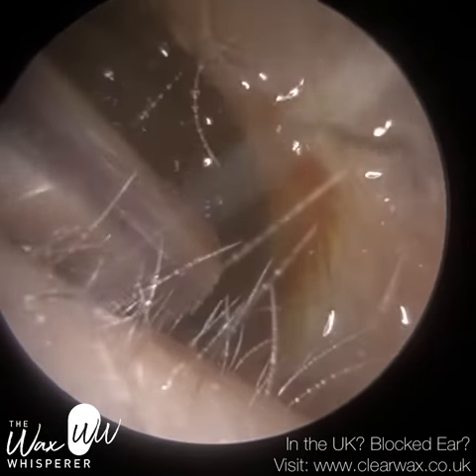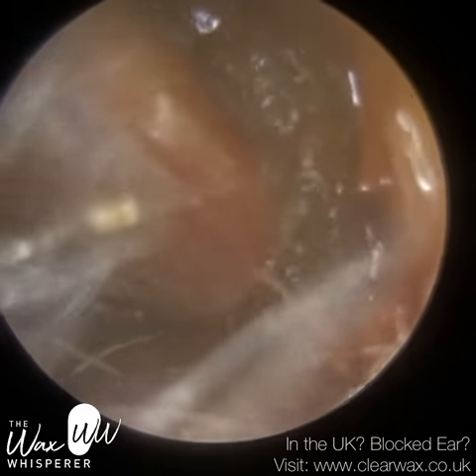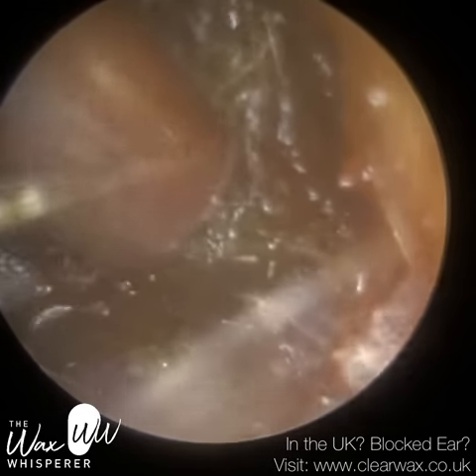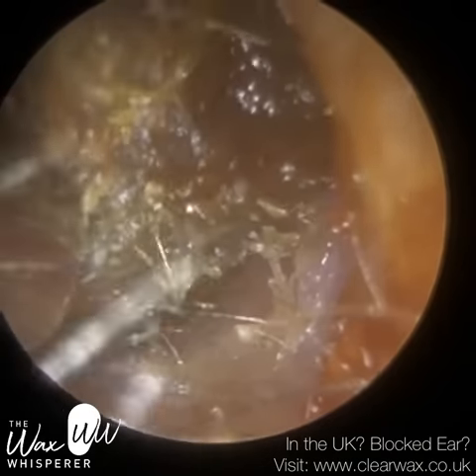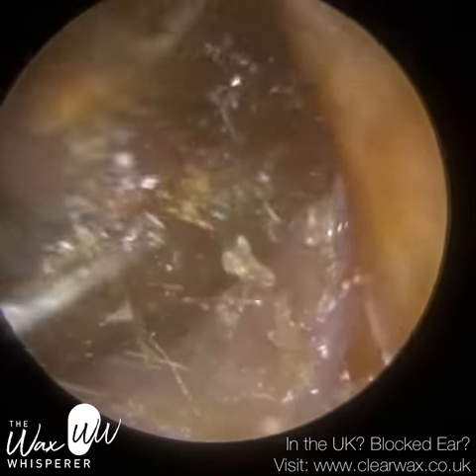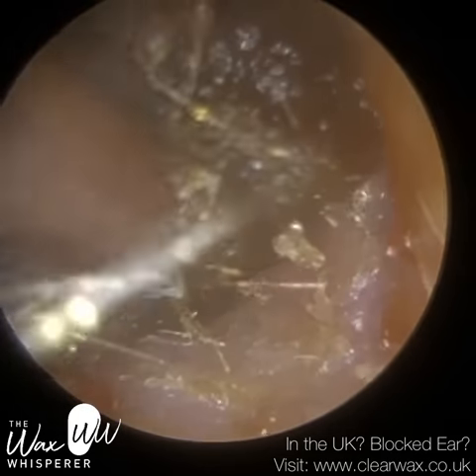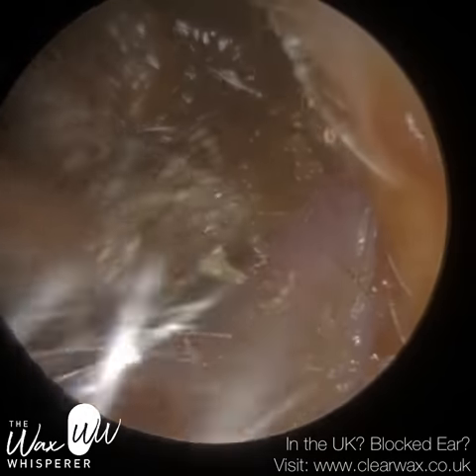It was actually the patient's friends and family who were complaining that they felt the patient wasn't hearing so well. So just beginning with microsuction using a standard solenoid suction probe. The wax is quite firm and therefore I immediately instilled some medical grade olive oil spray, which helps to soften the wax. It also helps to obtain a better suction grip.